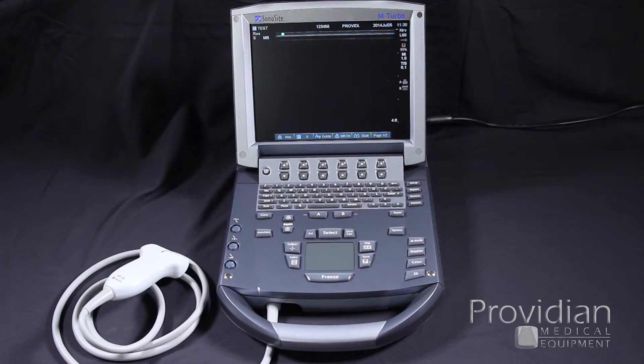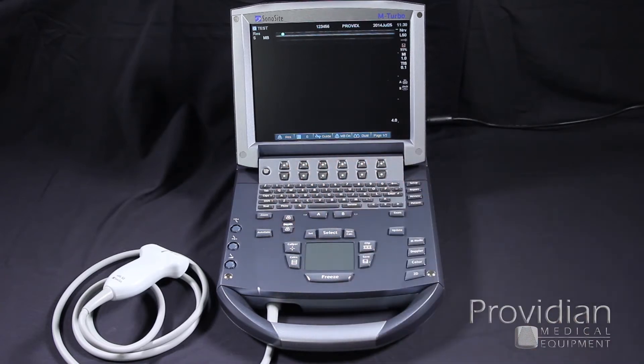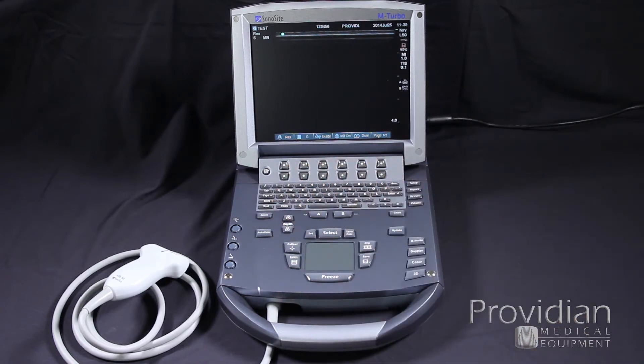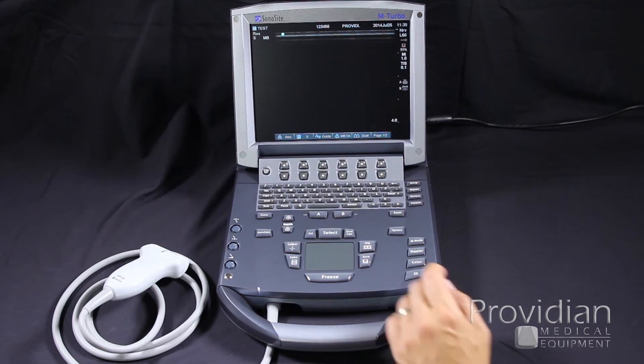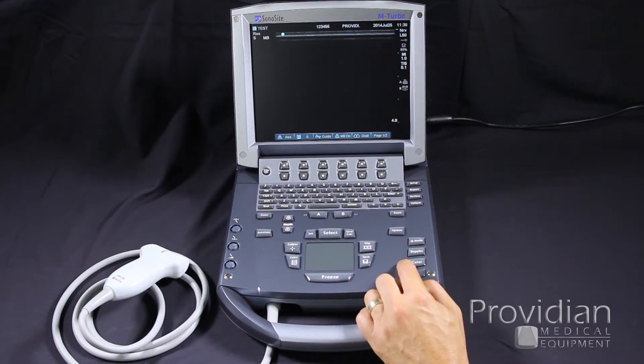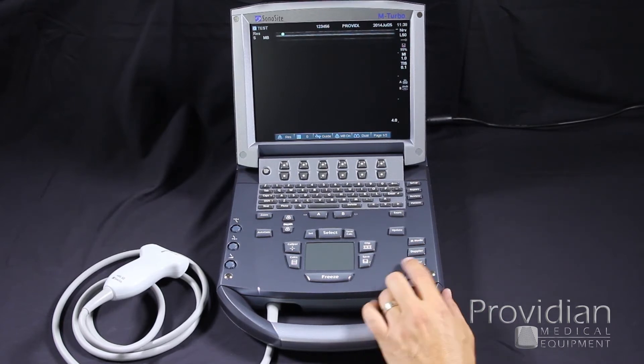We've seen how to do the imaging in 2D and how to use the soft menus. Let's show what we can do with the Doppler. First, let's start with the color Doppler.